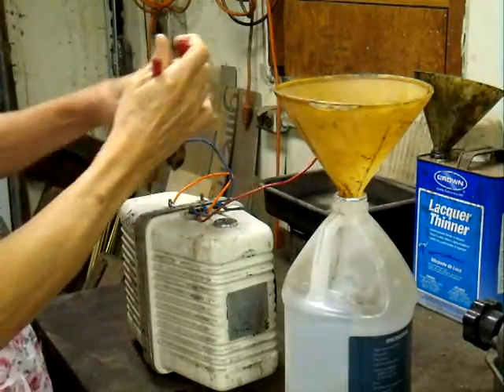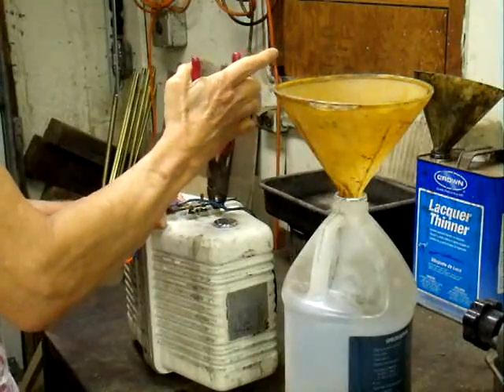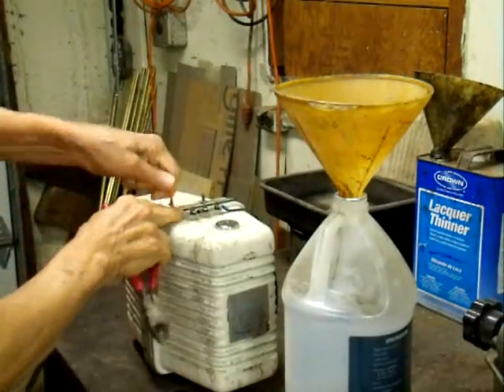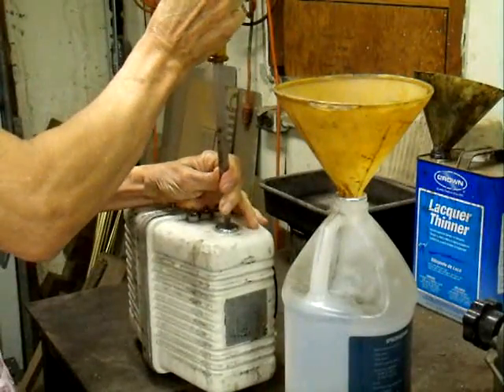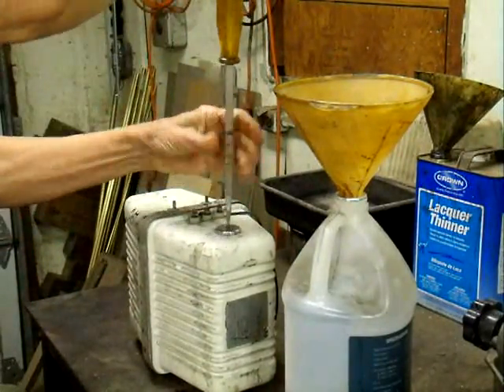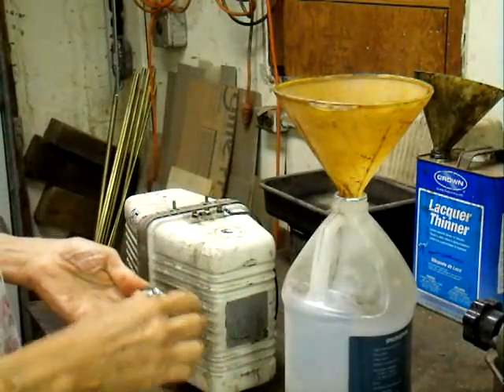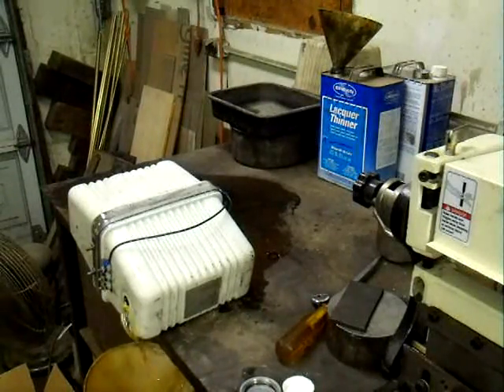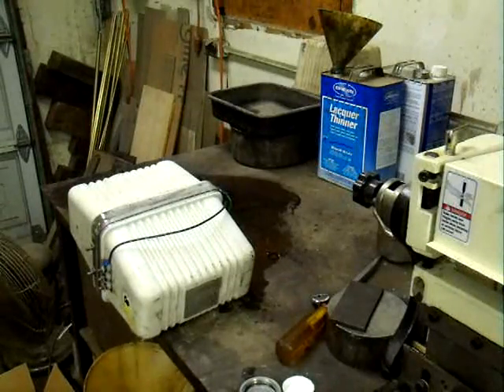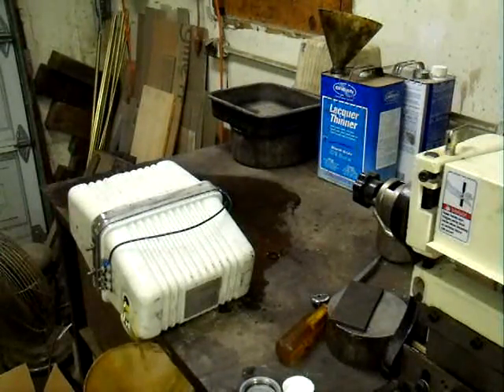We'll get these wires out of the way. The oil is pouring out now into the funnel. We'll just go ahead and let that drain — it'll take about five minutes for it to all get out of there.